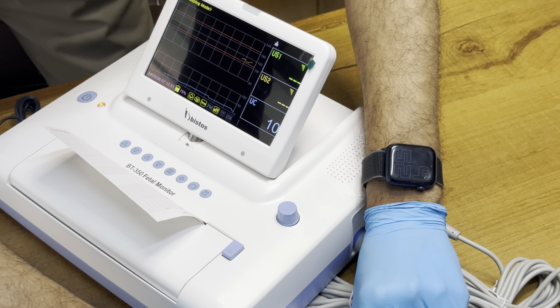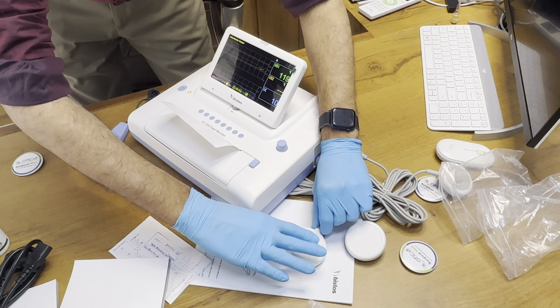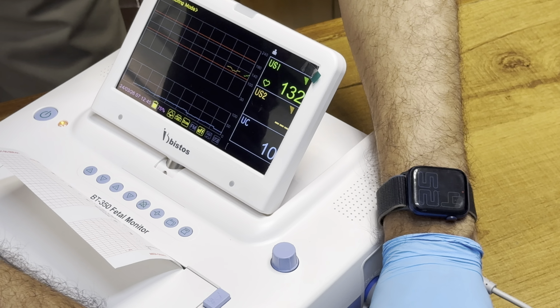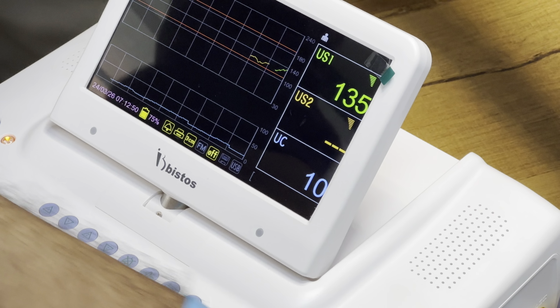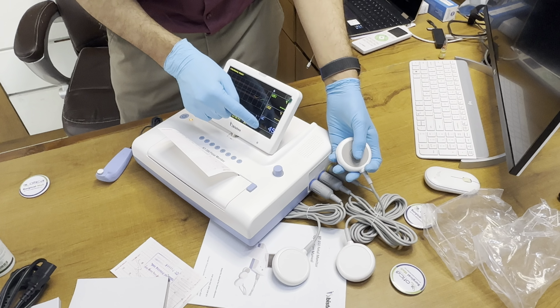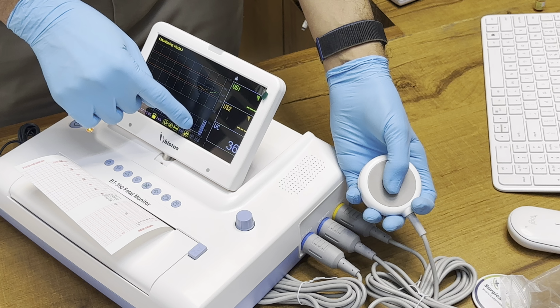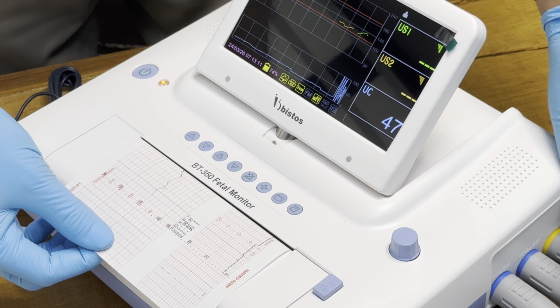It is testing, first of all, ultrasound 2, and this is for ultrasound 1. Ultrasound 2 will indicate as yellow, and ultrasound 1 will indicate as green. So you can see the color combination on the graph also. And this is just a test, and this one is the toco. When you apply pressure on it, you can see the value change. Whenever there is any contraction from the belly, it will indicate here, and you can see the indication of contraction on this graph. You can see the printing has also started.